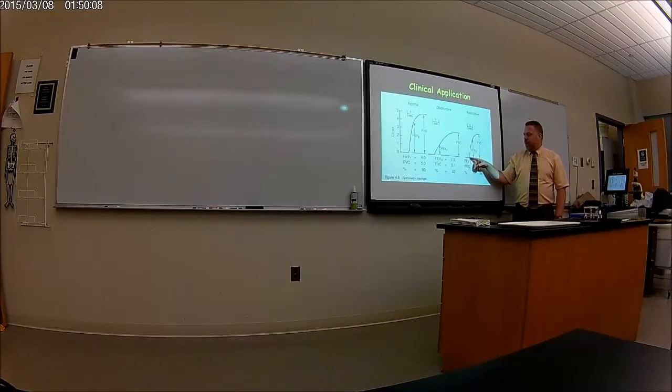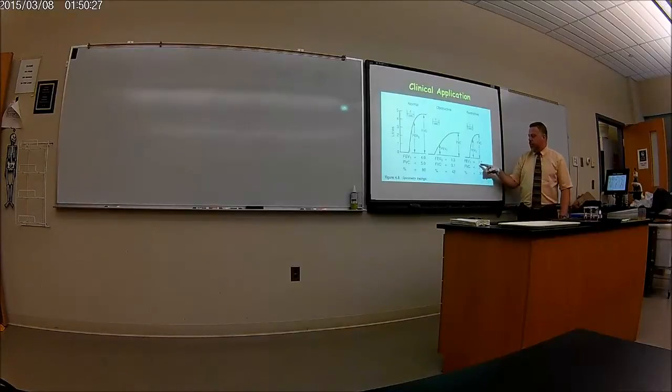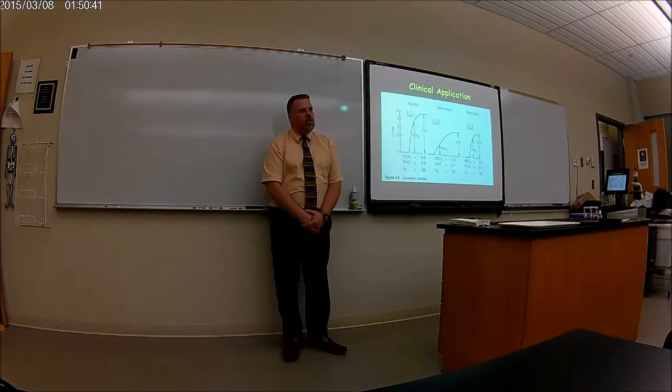Most of it comes out very fast. This is like 3 liters that comes out. But how much came out in the first second? Well, because they have a lot of elastic fibers around there, a whole lot's going to come out in the first second. So now, in this case, 2.8 divided by 3.1 comes to 90%. So if the number is very high, it's got to be a restrictive disease. Does that make sense? All right?